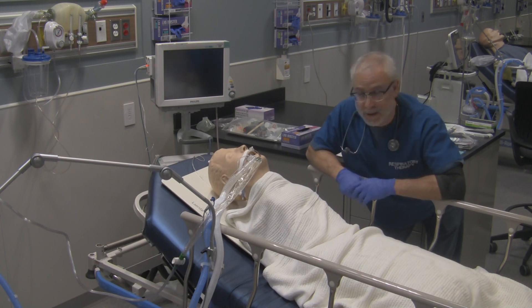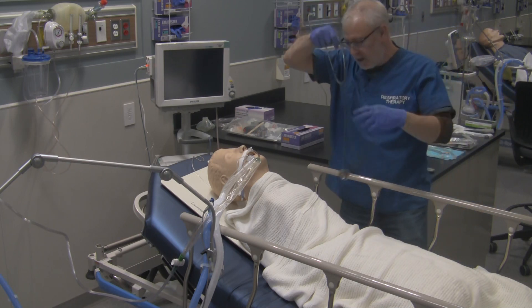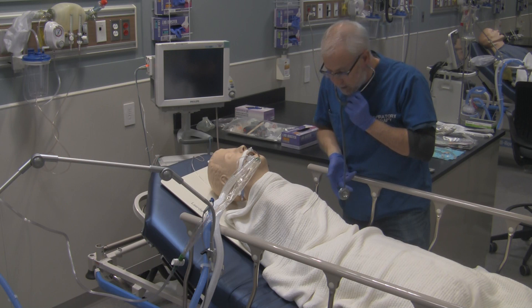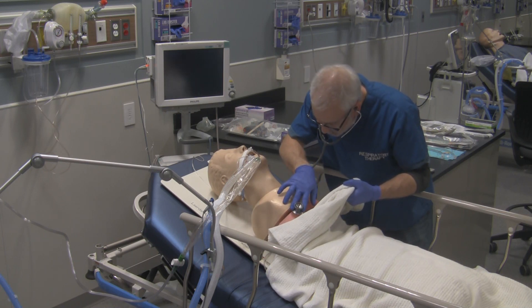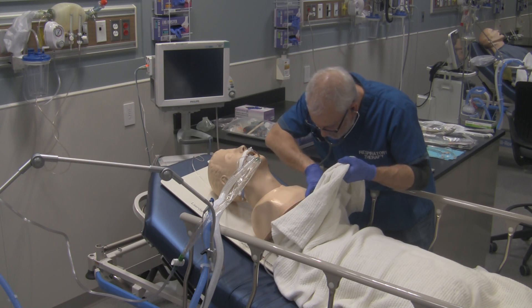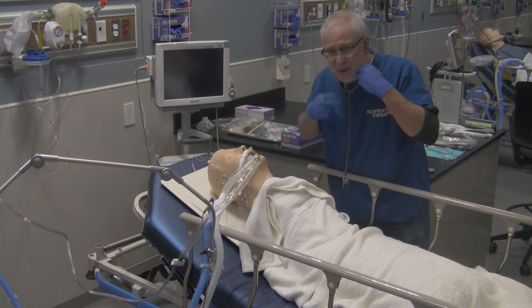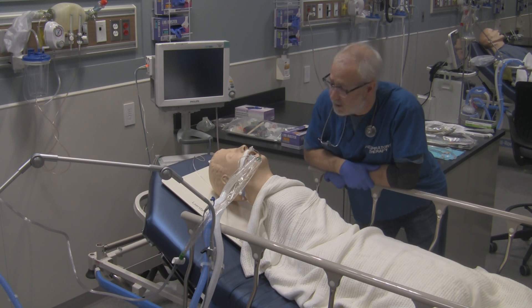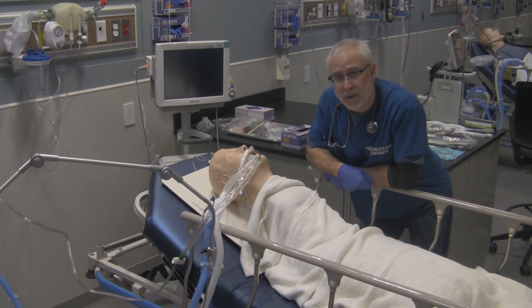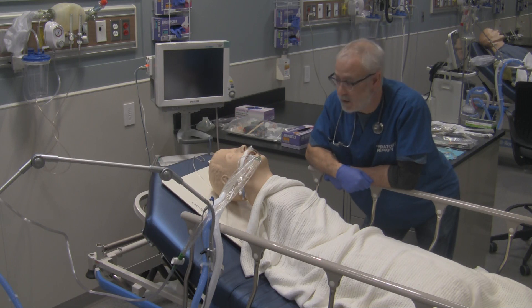Assume everything is on and working for this demonstration. Always ensure the patient requires suctioning before you suction them. Give them a good listen with your stethoscope — tell the patient what you're going to do. Take a listen as the ventilator delivers a breath, working your way down in an orderly fashion, listening anteriorly as well as laterally. What I hear is coarse crackles and some wheezes, so I know this patient needs suctioning. You can also observe the airway: secretions are visible going in with each ventilator breath and coming out on exhalation — another telltale sign suctioning is required.